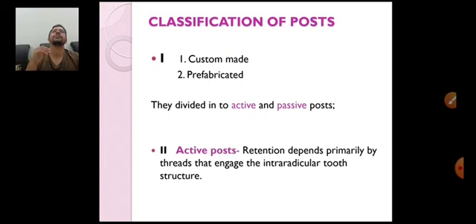And if you take a screw or a nail of 4 millimeter diameter and try to put it inside that drill hole, it will go into that hole very easily. There won't be any hindrance. It will go very easily, and if you try to pull it out, it will be retrieved very easily. So it's easy to go inside and come out.